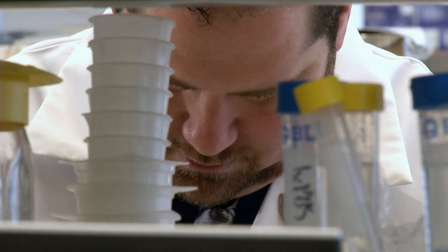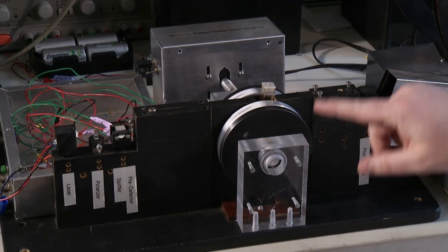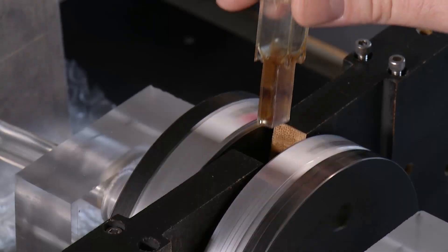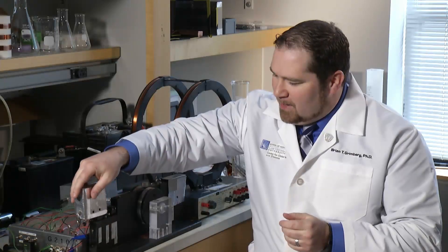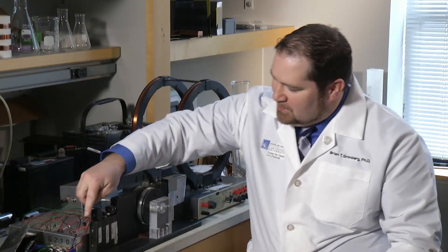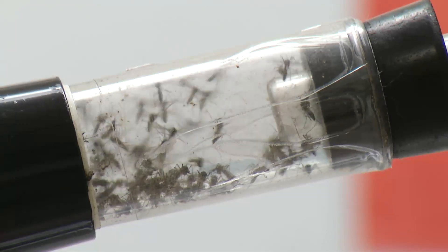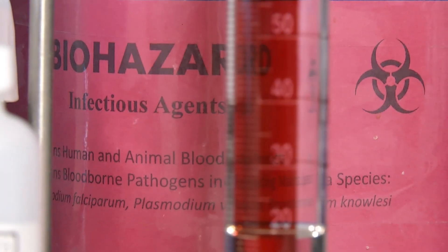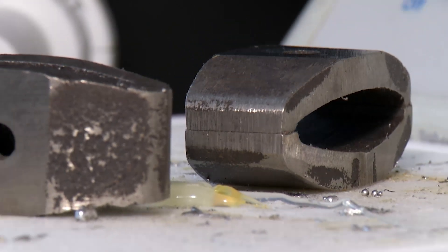Malaria researchers at Case Western Reserve University have developed this portable malaria detector. It's a laser with magnets on each side. A blood sample mixed with water goes in the center. A low-powered laser shoots through the blood sample while the magnets spin around. Malaria parasites are full of compacted iron, which they release into the blood, and the magnets and laser detect these iron particles.